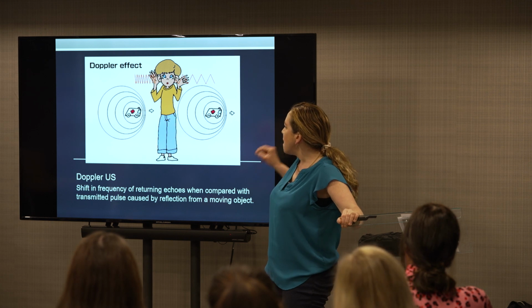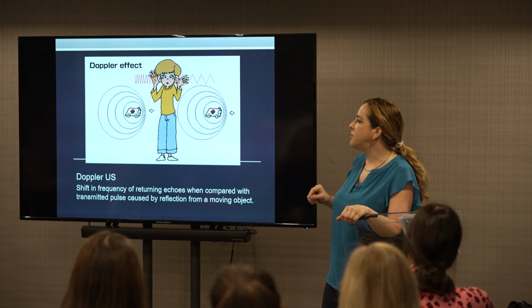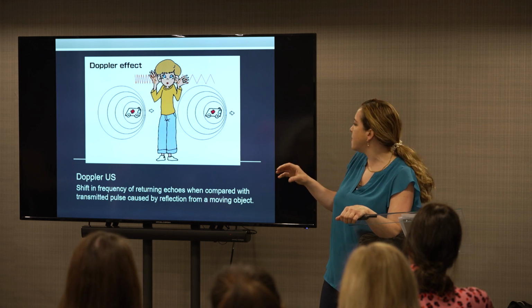So that's what the ultrasound machine is using for the Doppler effect. It's using the sound beams reflected off the blood cells and the components of blood that are flowing through the vessels.